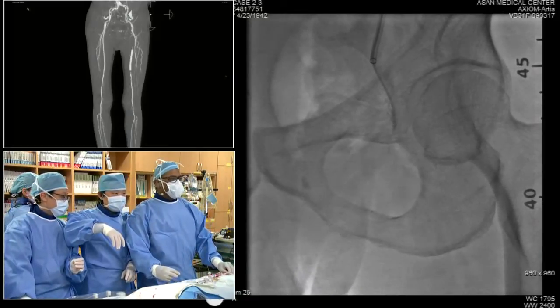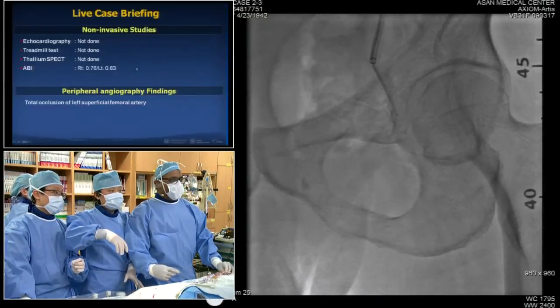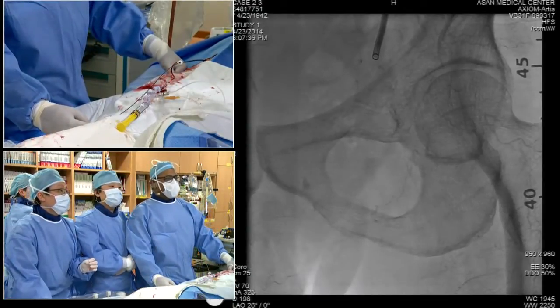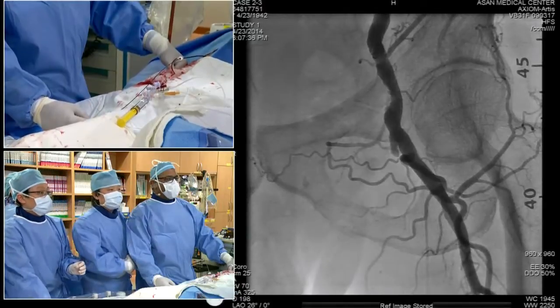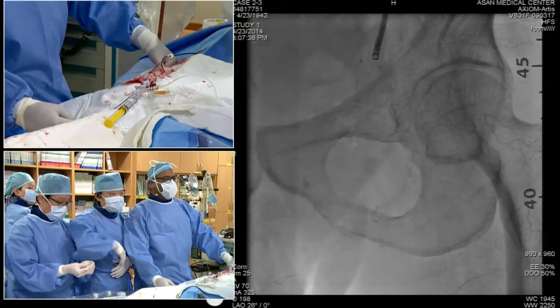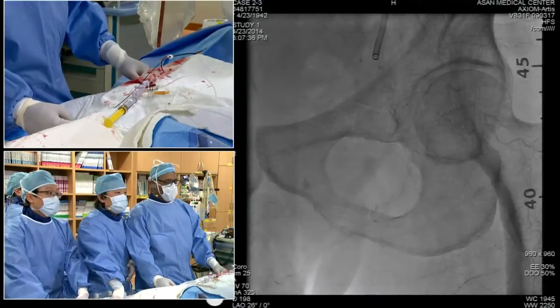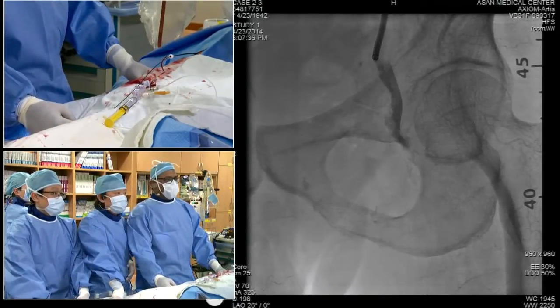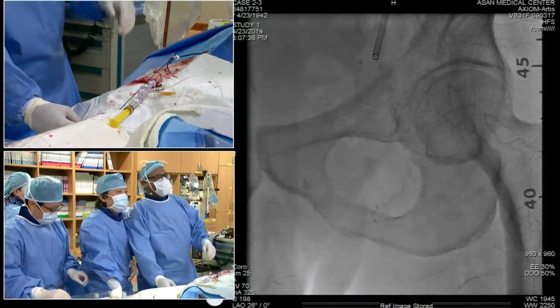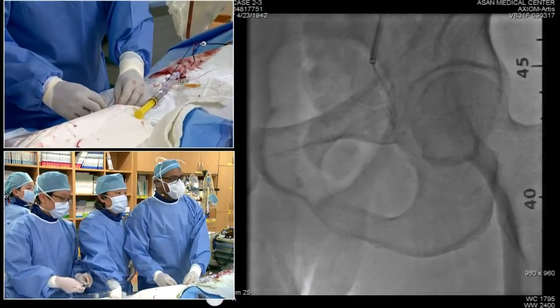What I like doing here in this case is to really put your nose in it, if you will. Could you put up a mask to show me using bony landmarks where that's perfect. Great, stop right there. If we look at the ischial tuberosity and freeze that, we're going to get a sense of where we need to move. Okay, freeze that, very good, thank you very much. Do we have a torquer that we can put on the back of this?